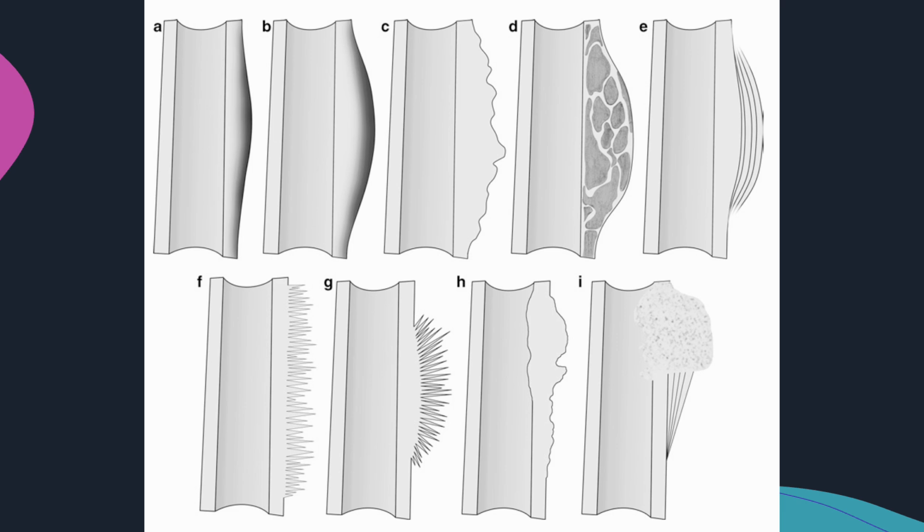Codman's triangle is the name given to a periosteal reaction that occurs when bone lesions grow so aggressively they lift the periosteum off the bone and do not allow the periosteum to lay down new bone. It is a pattern of interrupted periosteal reaction where the periosteum gets lifted at either end of the aggressive lesion. The central aspect of the lesion does not have any overlying ossification.